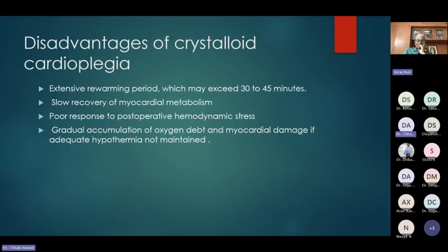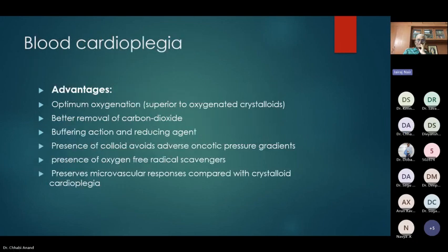Disadvantages of crystalloid cardioplegia: an extensive rewarming period, which may last 30 to 45 minutes, slow recovery of myocardial metabolism, poor response to postoperative hemodynamic stress, and gradual accumulation of oxygen debt and myocardial damage if adequate hypothermia is not maintained.